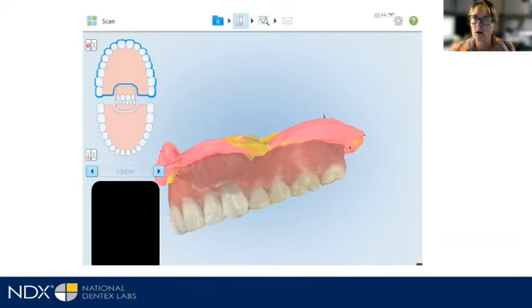It was on a cast, right? So it's on a plaster cast, a stone cast, not a human. So you will notice that some of the replication of the muscle leaves a little bit to be desired because it was not done on a real person. So full disclosure there.